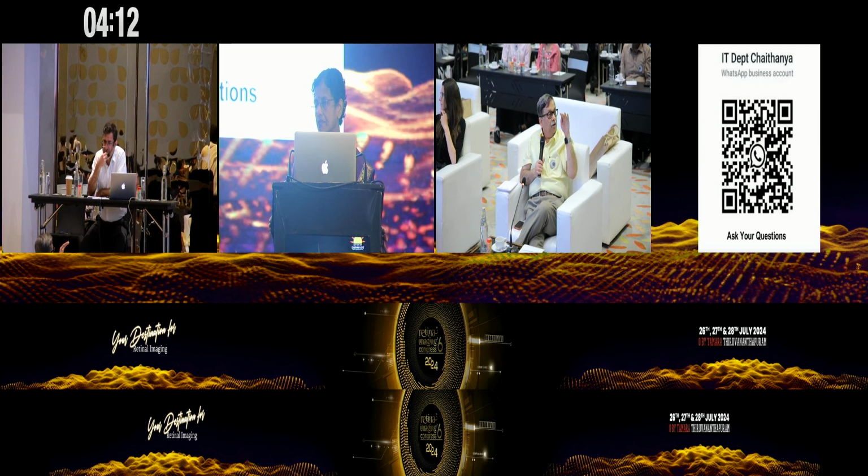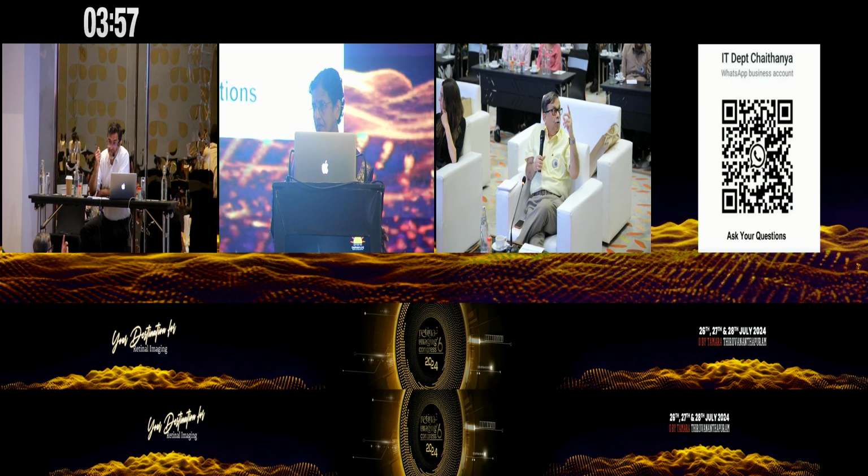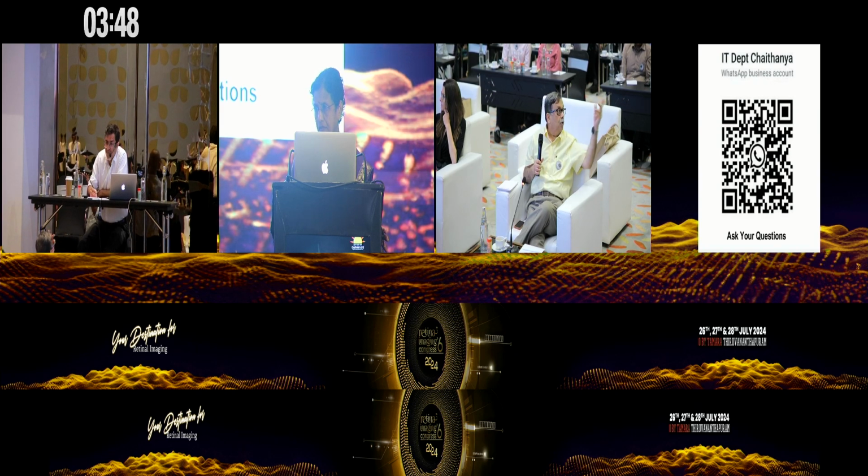So all three of them will give you the same kind of picture. Is it possible that they behave differently to treatment also? If you take all three of them as one, your results may actually get affected, and you may get no positive response where a particular group works and the others don't. So I think it's very important that this categorization be not just phenotypic on the fundus photograph, but also based on OCT. And the second thing is the locational thing, which is not being paid attention to.